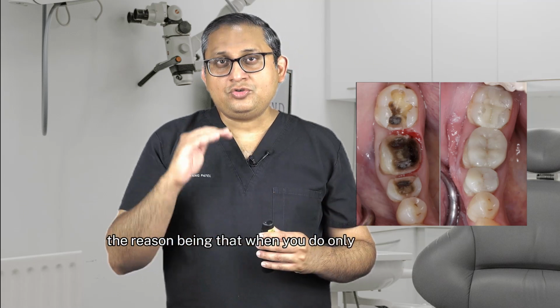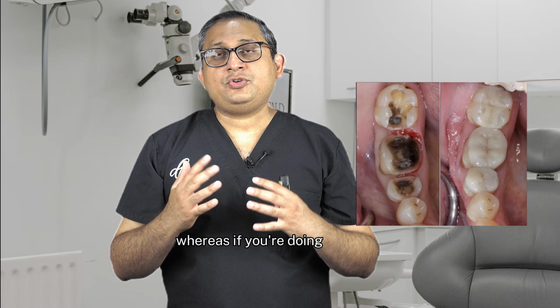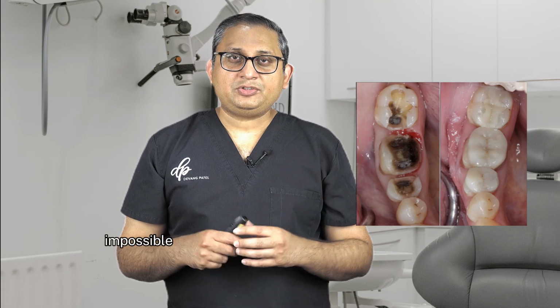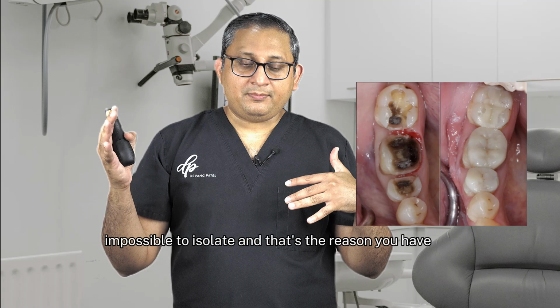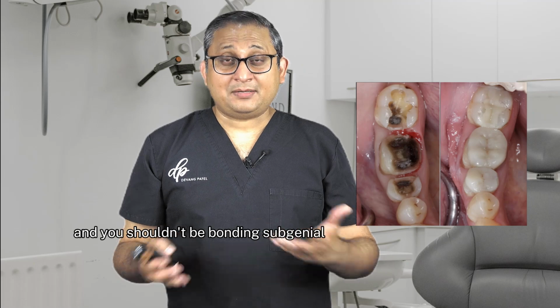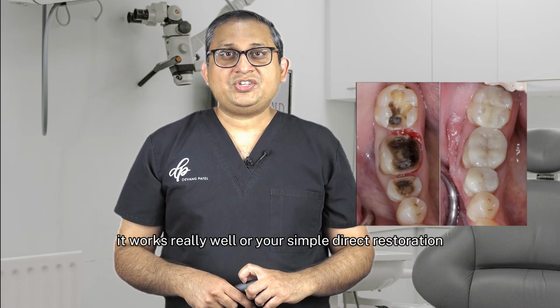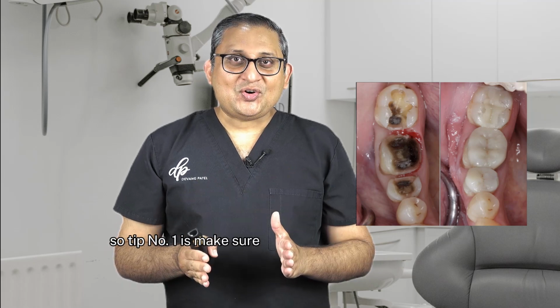The reason being that when you do an onlay, as I said before, we are doing composite to composite bonding. Whereas if you're doing a crown, first of all, if it's a subgingival margin, it's impossible to isolate, and that's the reason you have the cement which is just not compatible with that, and you shouldn't be bonding a subgingival margin when you cannot isolate. So you need to use conventional cement, and that's the reason this technique doesn't work for crowns. For onlays it works really well, or for your simple direct restoration. So tip number 1 is make sure that you know when to do DME and when to call it a day and say, look, this is for a crown.